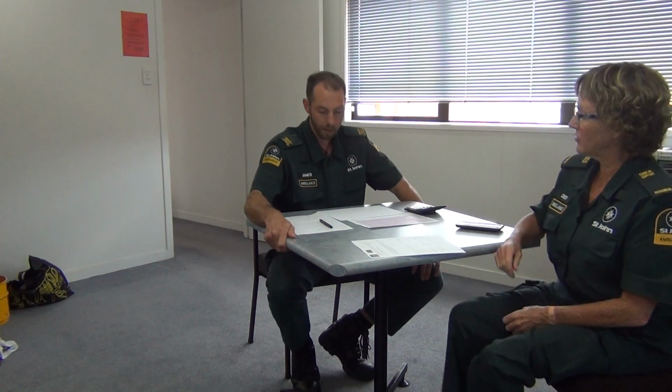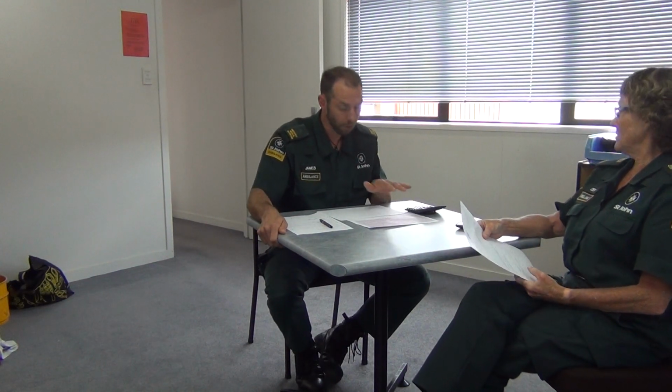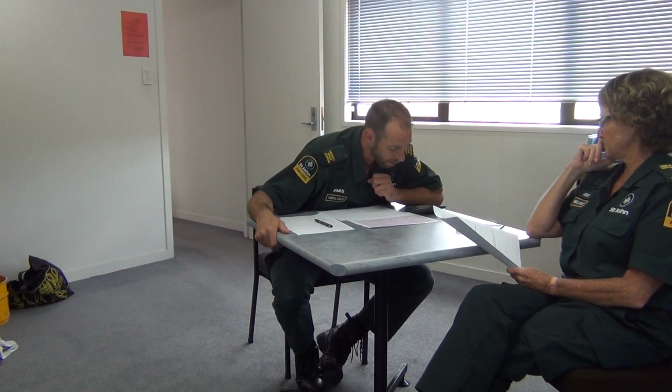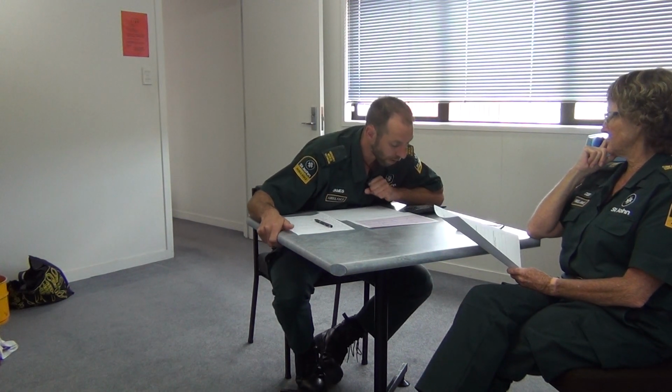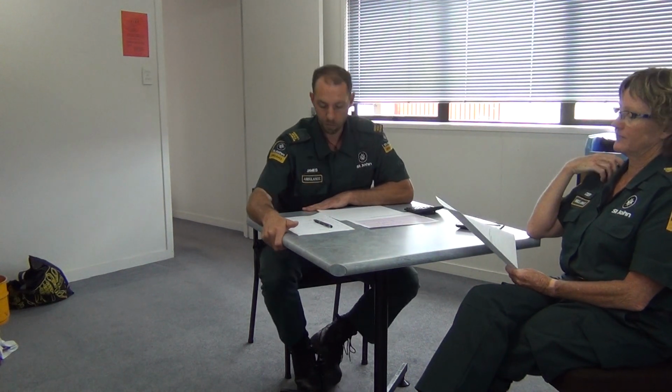Okay. Yeah, and I've got a couple of questions about the scenario. I've just missed one thing as well. The PR interval is between 0.12 and 0.20, so that's also normal. It's not too long.